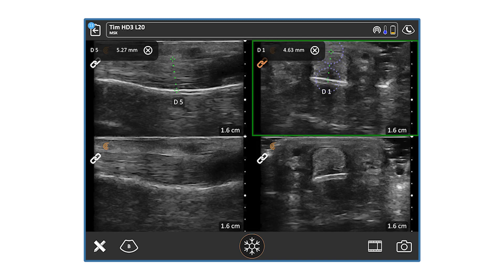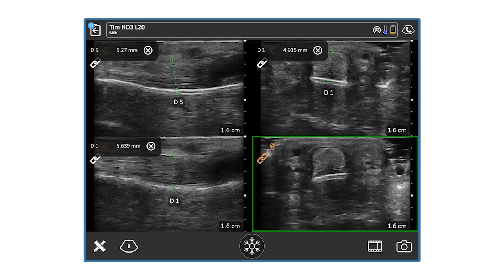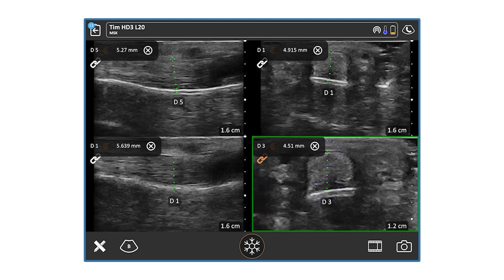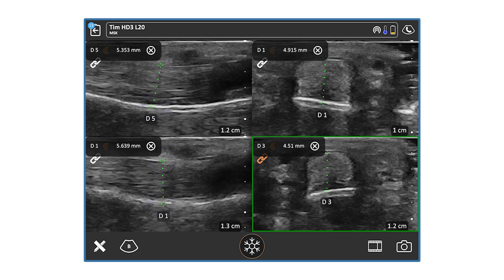If I need to adjust, I can click to fine-tune — for example, adjusting distance one to make sure I have the best parameter. I can then compare and contrast to the left middle finger, again selecting the distance, selecting the bone, and measuring the top of flexor digitorum superficialis. For the fourth image, I can select that distance and measure as needed. I can also zoom in and zoom out to make any fine-tune adjustments to ensure I'm getting the exact distance I need.